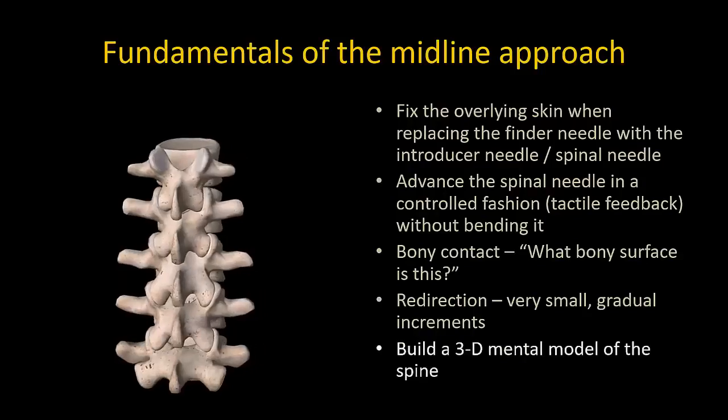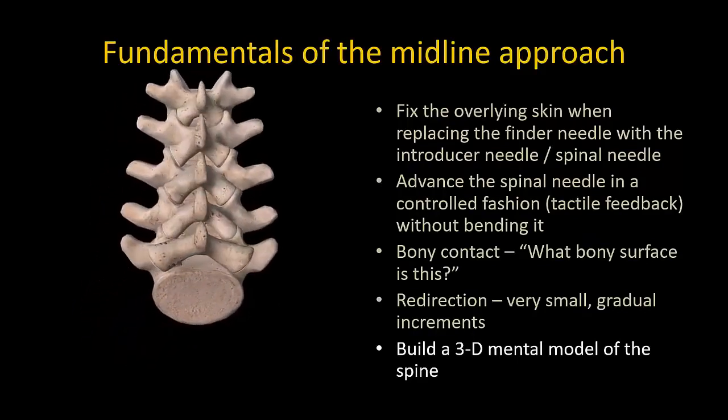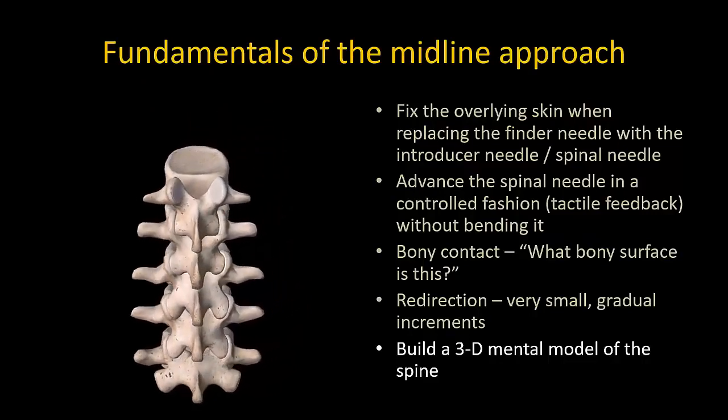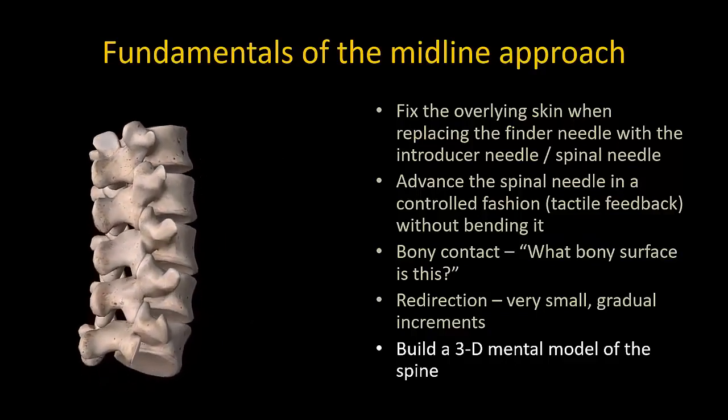Finally, it helps to have a three-dimensional model of the spine in your mind, and as you palpate landmarks or contact bone with your needle, you are building and confirming this mental model so that you have a good idea of where you need to redirect your needle to navigate into the interlaminar space.